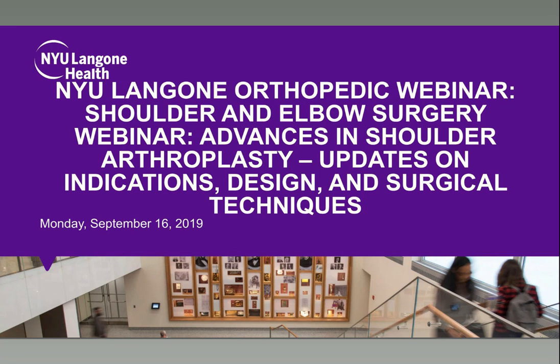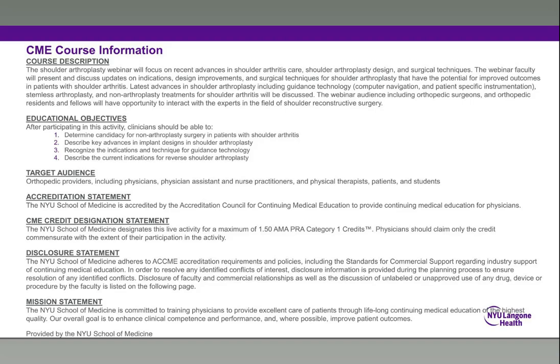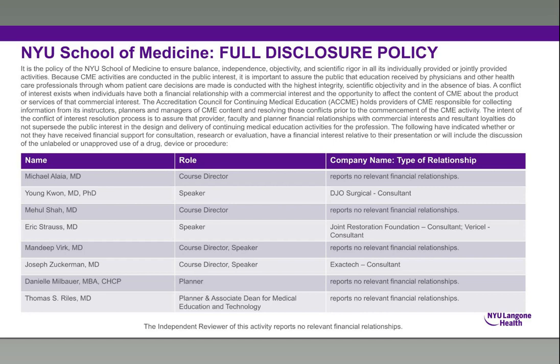Dr. Virk, yes. I've had to do a few hemiarthroplasties for failed anatomics with inadequate bone stock, as Dr. Kwon points out. But in these situations, it's wound up to be stage one of a two-stage procedure, bone grafting the glenoid and then reimplanting a reverse at a later time.